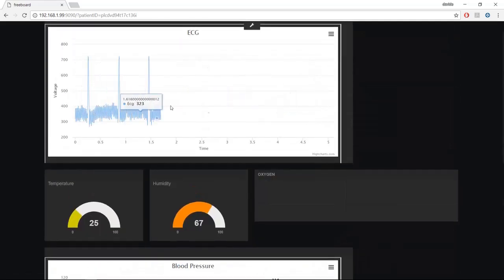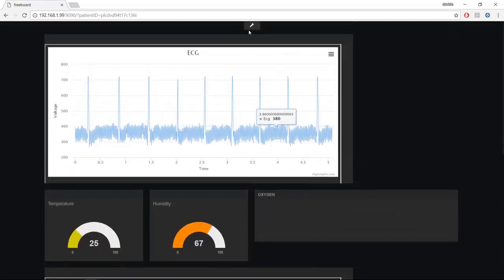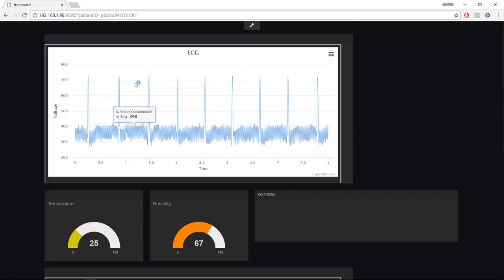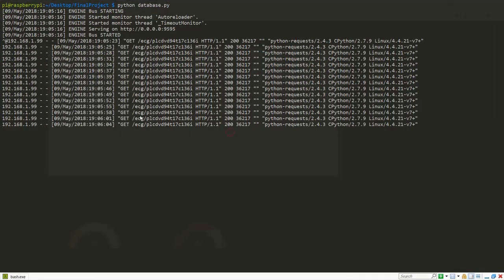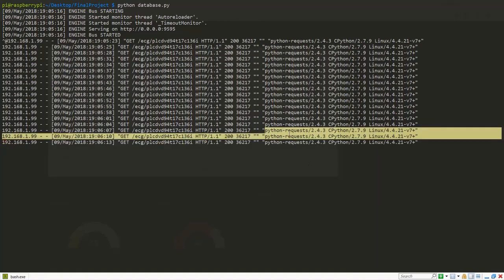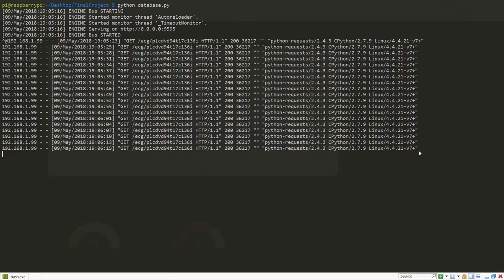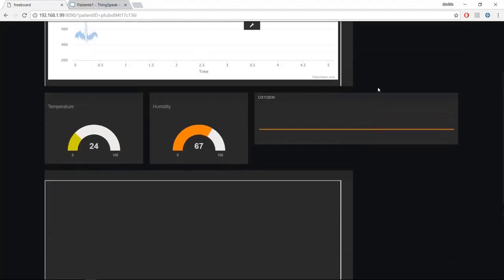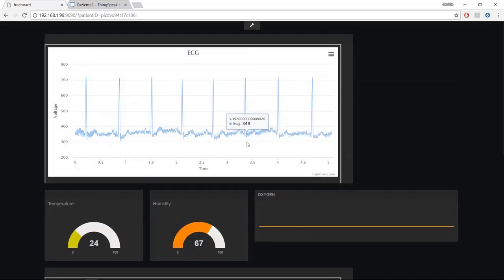If the recording of the ECG trace is happening at this time, we will see the new ECG trace every 5 seconds. At the same time, we can see that every 5 seconds, because every 5 seconds the ECG trace is uploaded, the database receives a request. This database is also used to retrieve the image related to the ECG trace. Here we have a new recording which also has a better quality.